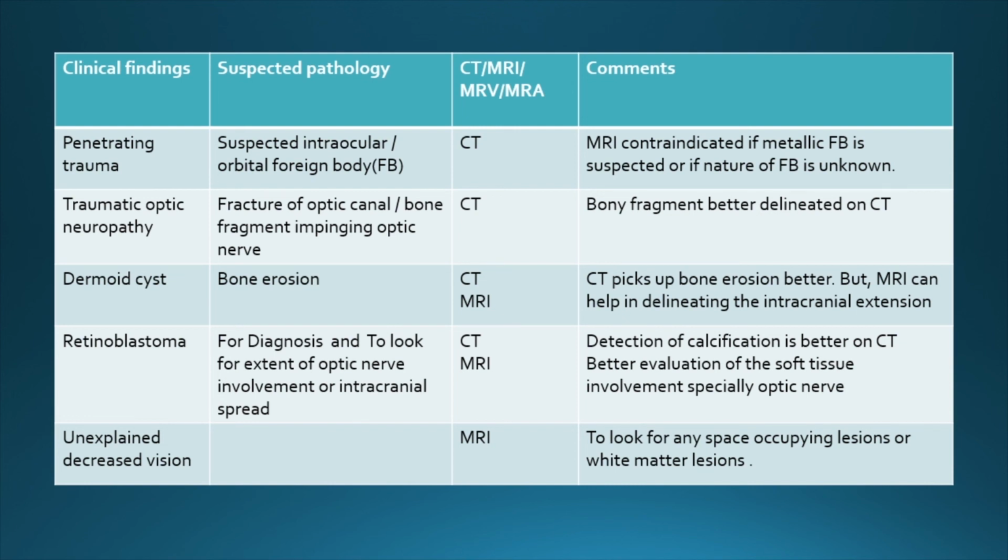MR with contrast for all intraocular tumors. So that is how you should remember. Of second tumors if you do CT on a retinoblastoma, right? Yes. Bone tumors, mesenchymal tumors, metastasis.